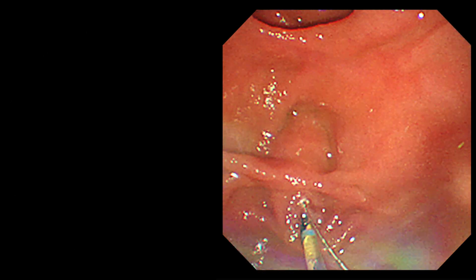A biliary sphincterotomy is performed. My plan is to remove the smaller stones with a balloon catheter and then tackle the large stone with a cholangioscope and electrohydraulic lithotripsy.